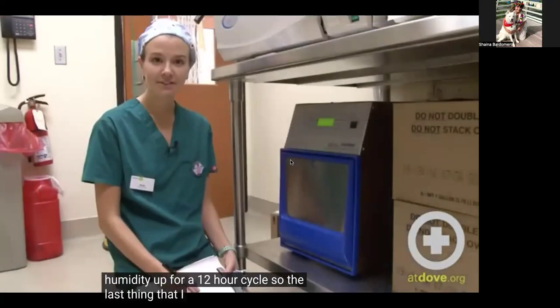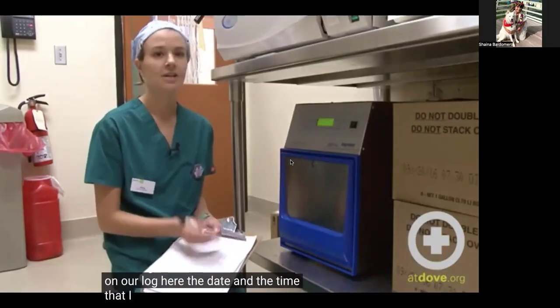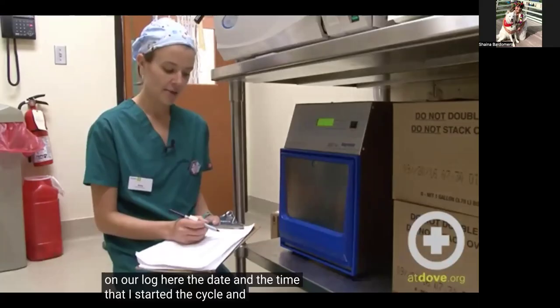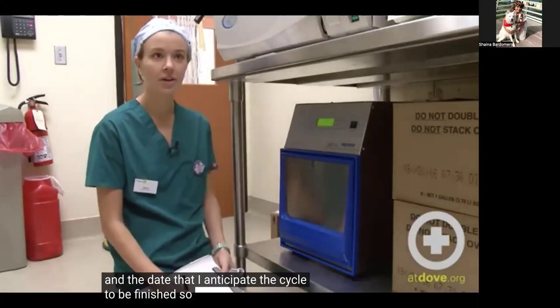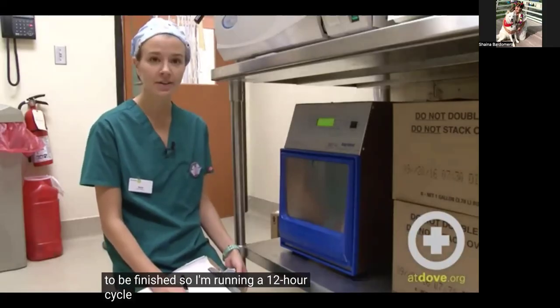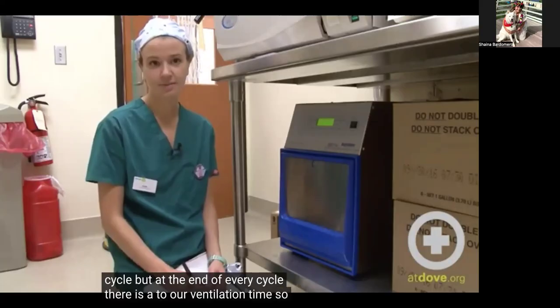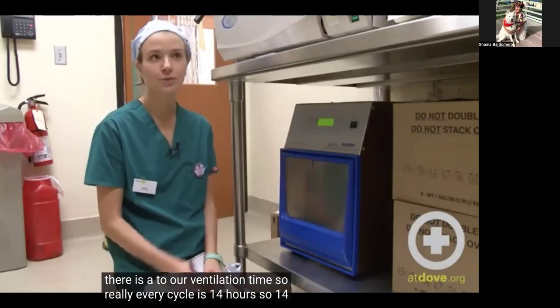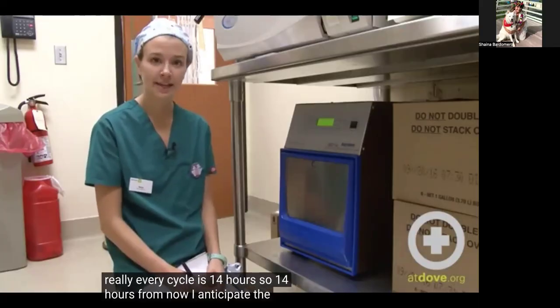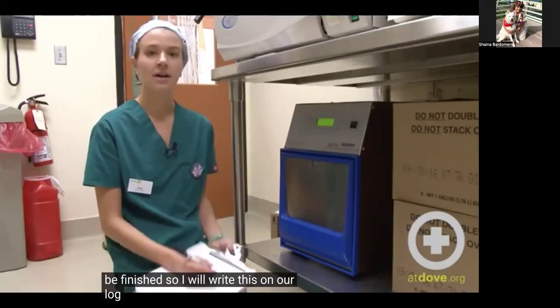So the last thing that I want to do is record on our log here the date and the time that I started the cycle and the time and the date that I anticipate the cycle to be finished. So I'm running a 12-hour cycle, but at the end of every cycle there is a 2-hour ventilation time. So really every cycle is 14 hours. So 14 hours from now I anticipate the cycle to be finished. So I will write this on our log here.